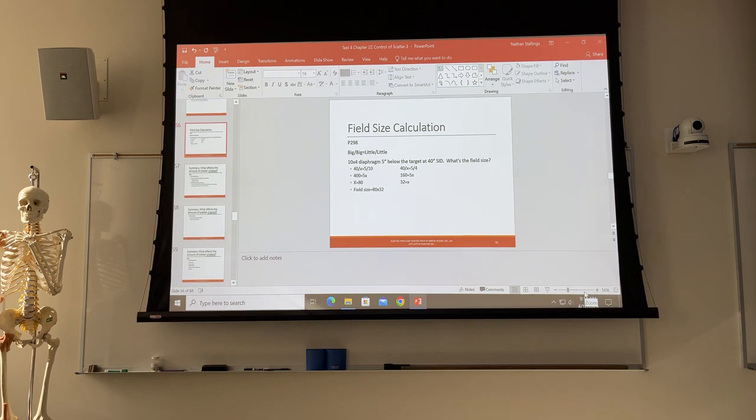So that's figure 22.11, figure on top right hand side. And then on figure 22.10, you've got the different types of beam limiting devices, and that's kind of where the video from, was it Friday, left off, was with beam limiting devices, calculation of field size.